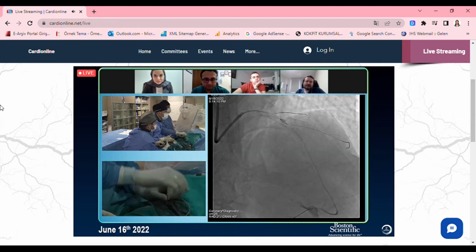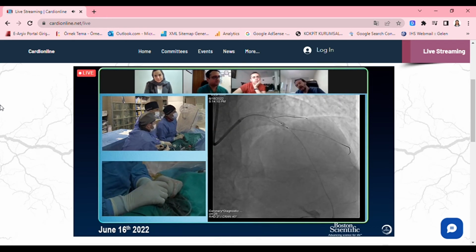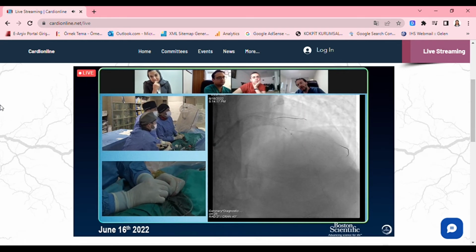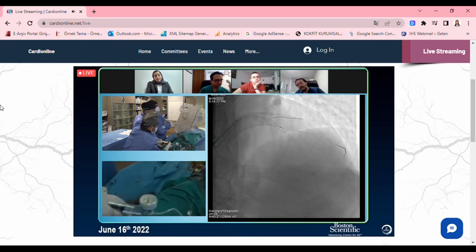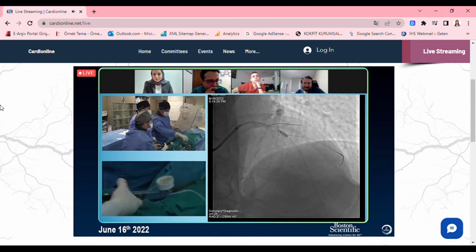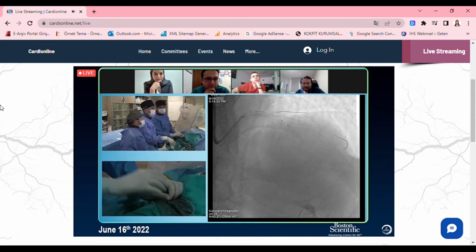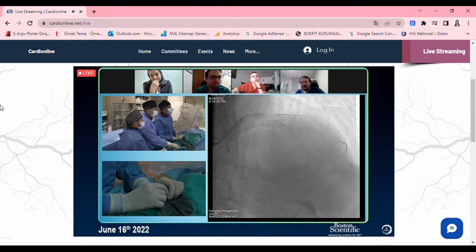Interesting to see. Go up to 10. We have a wire there, and we are at 10. You can go also 12 with the cutting balloon. Do you think so? It's possible. We will see. Now it's okay. Interesting is with IVL, we can do it. It looks wide, and it wouldn't affect this. Maybe from the diagonal, 12, 14.